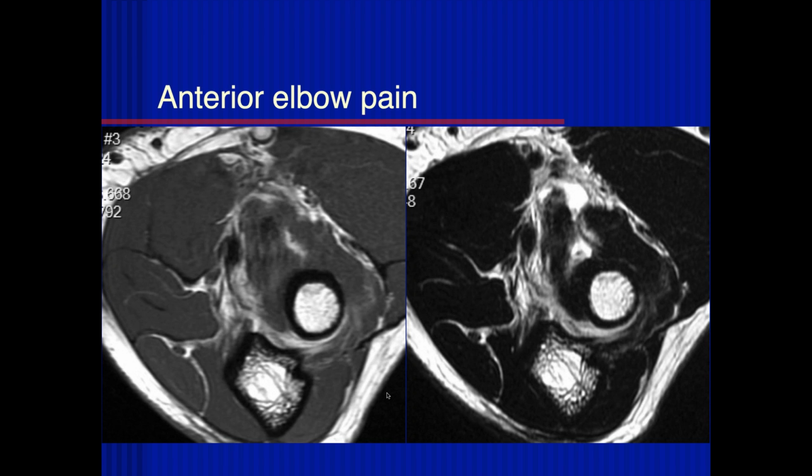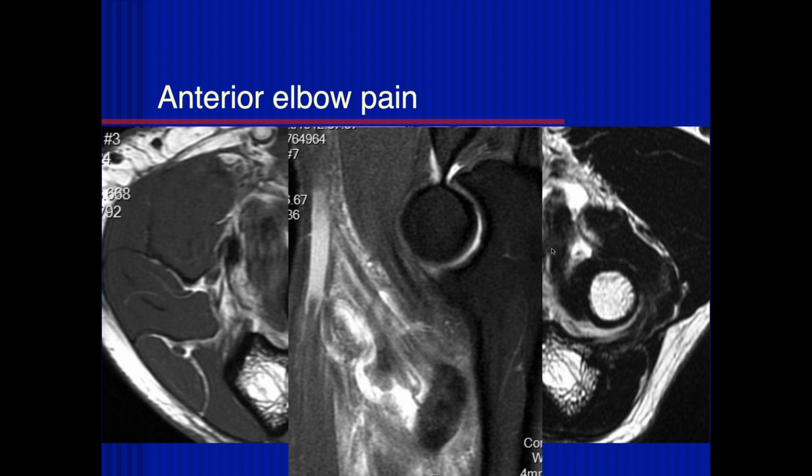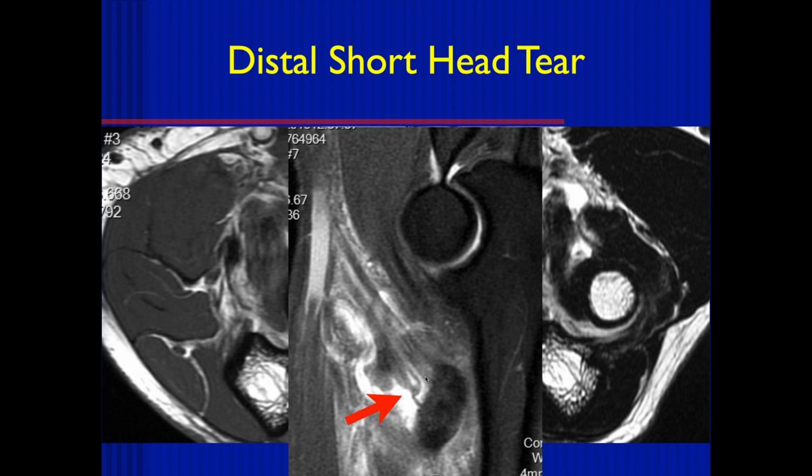Okay, so there's pretty significant thickening and irregularity involving that distal biceps tendon with surrounding fluid. I'm not sure if that's just surrounding edema, or if that's within the bicipital radial bursa. There's probably a high-grade partial tear. I don't think it's completely torn by the images we see. Yeah, and it primarily involves the short head. There's a lot of fluid in the bicipital radialis bursa, and a lot of tendinosis, partial tearing, and splaying of that tendon.